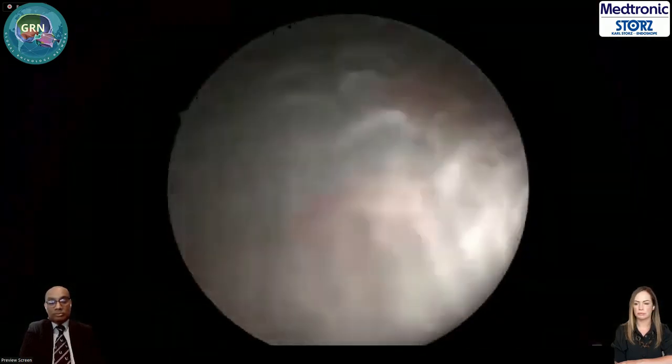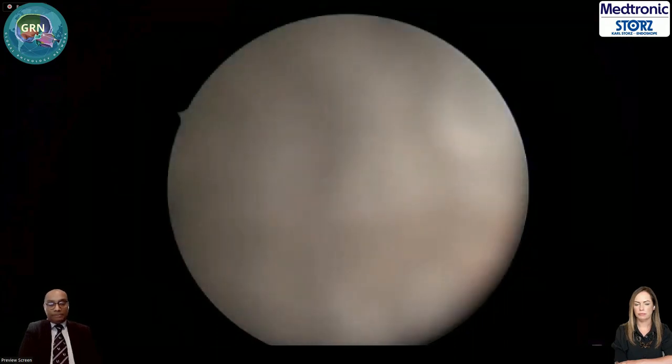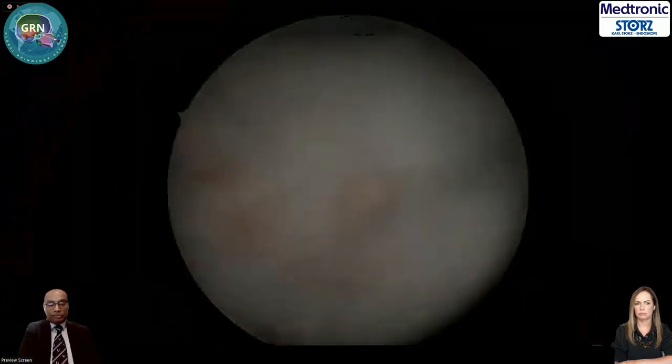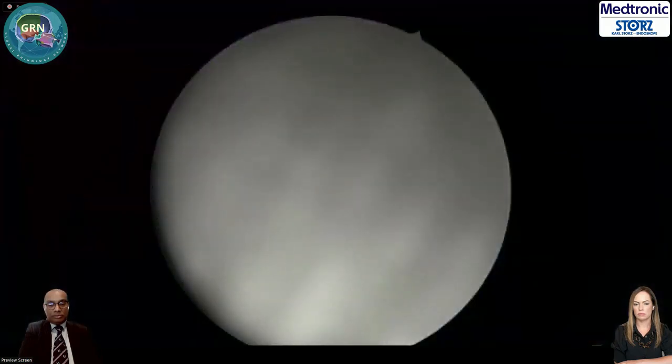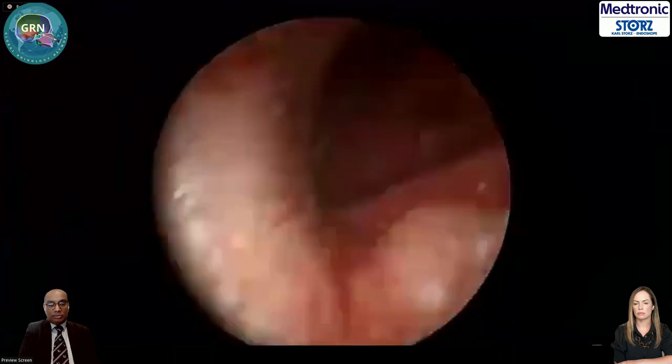Give me the suction. The cannula from before. The lacrimal recess is behind the lacrimal duct. So with this approach, with the prelacrimal, or when you don't do the complete maxillectomy, it's difficult to be managed.